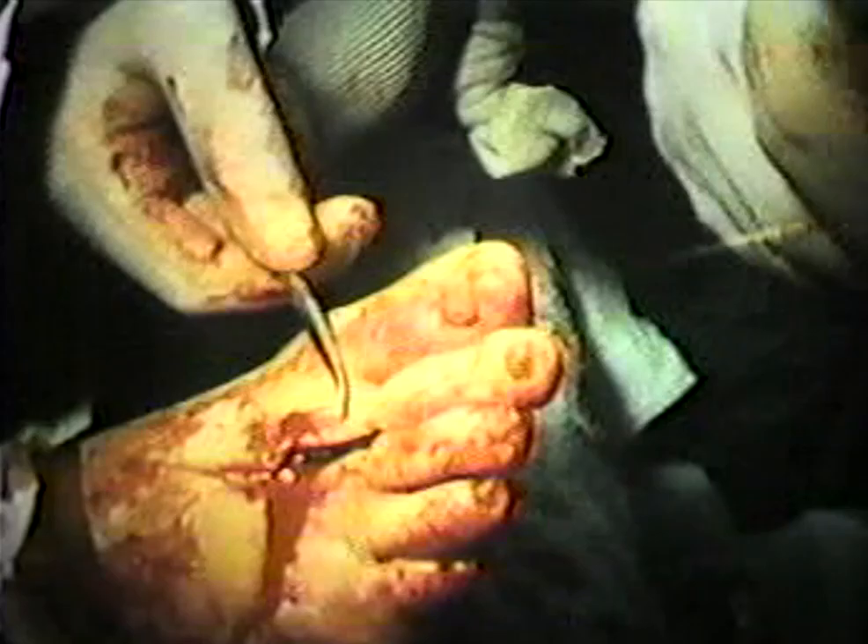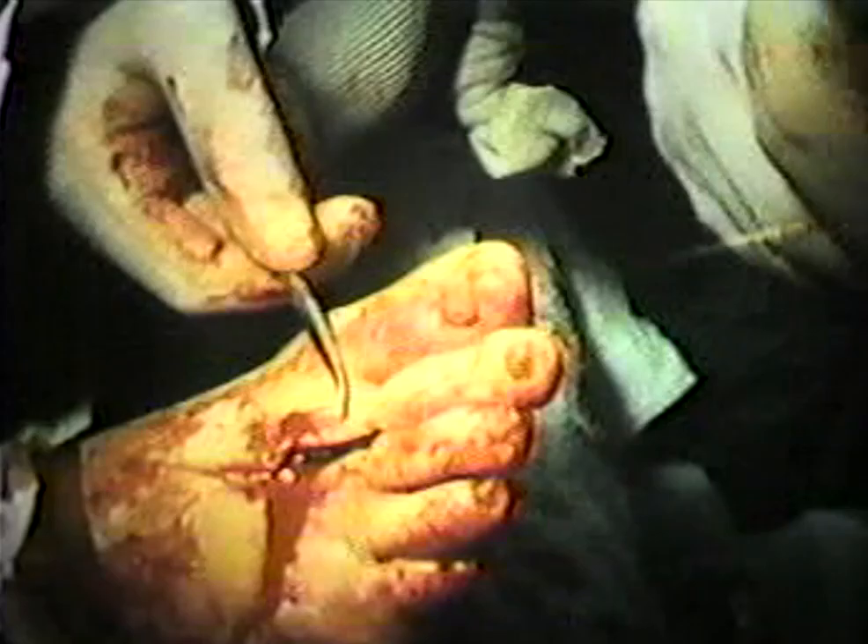The disadvantage of working with wire is that it always requires two people at all times to avoid kinks. As you can see, the assistant is holding the wire out, preventing looping.